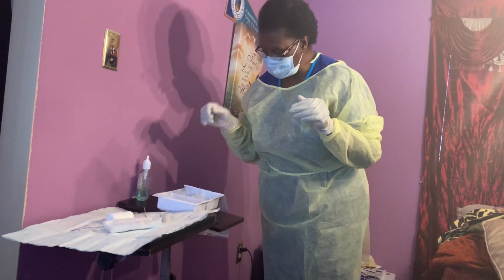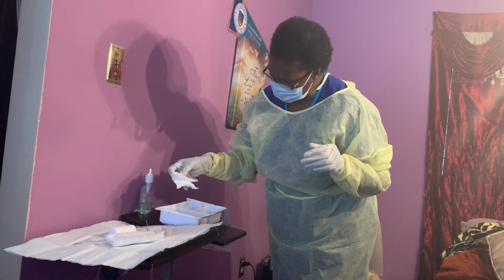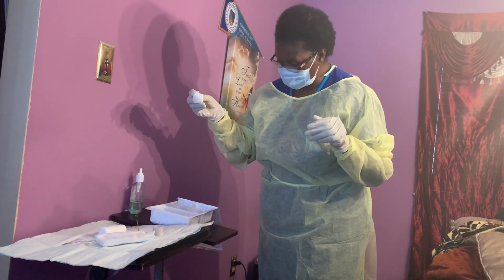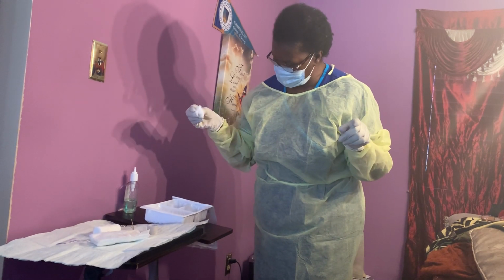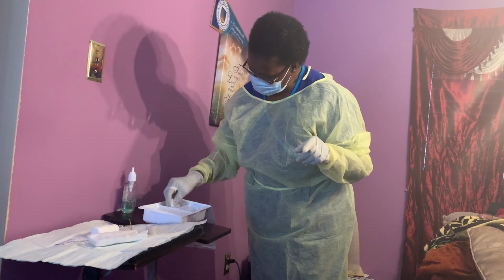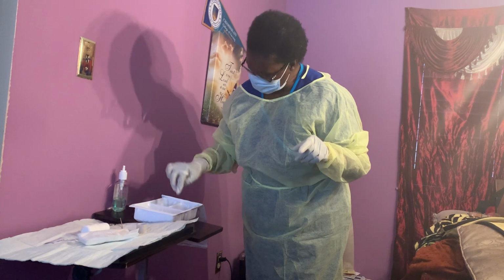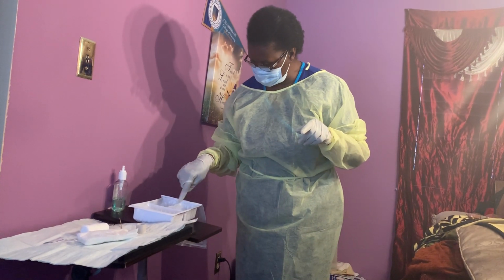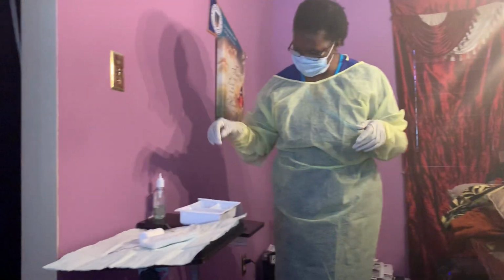So now that is done, I'm gonna use my sterile hand and pick up a gauze. So I'm gonna prepare my packing gauze. So I will dip it inside, squeeze, it's ready. Then I'll put it in the dry sterile field slot of the tray. Now that is done, now I'm gonna clean the wound.